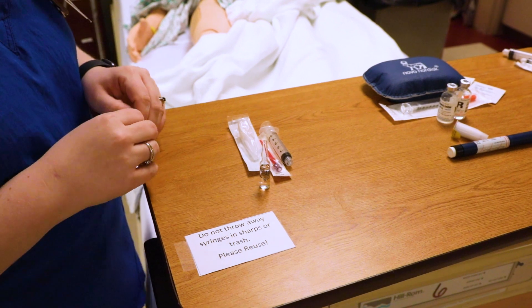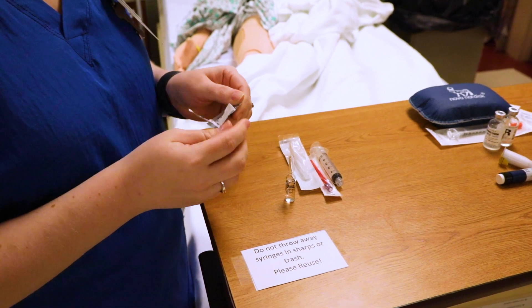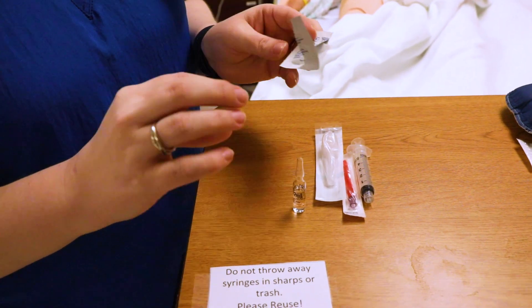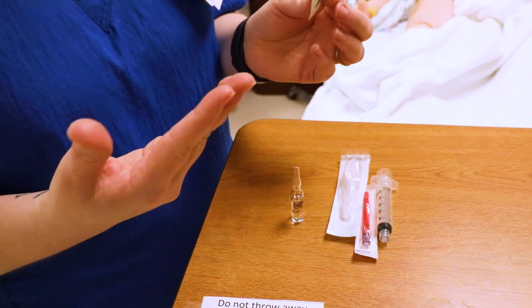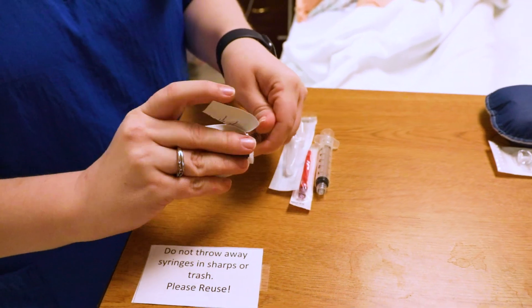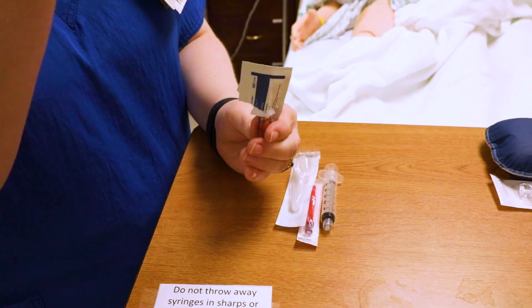I'm going to show you how to get some medication out of a glass ampoule. Make sure you're careful because it is glass and it does become sharp. I've seen a lot of people break the glass in a gauze; some people use alcohol. Make sure you're doing it however your facility tells you to do it. I like to put the glass in here and then rotate it a little bit — that helps clean the top.